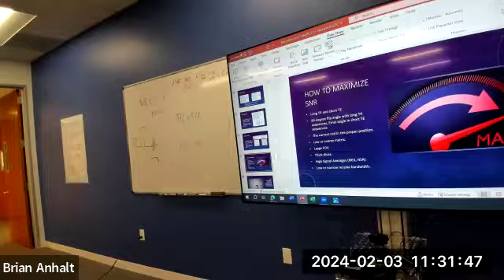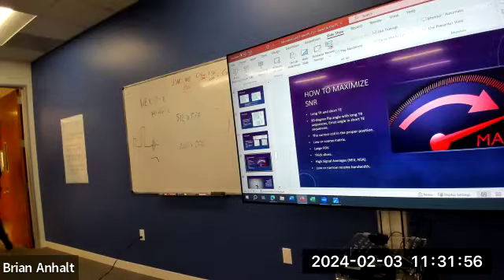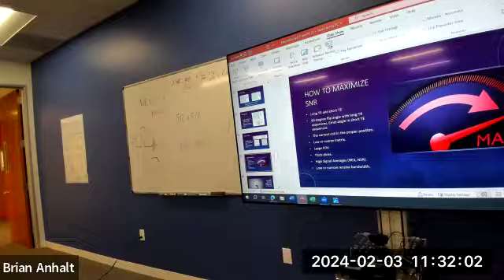Yeah, so just that, larger voxel. That's what slice thickness is. So a higher FOV has a higher... Higher, because you're picking up more. Okay, a higher slice thickness.